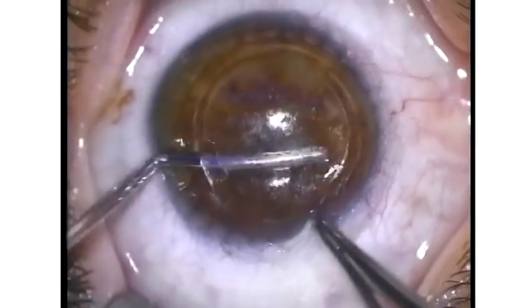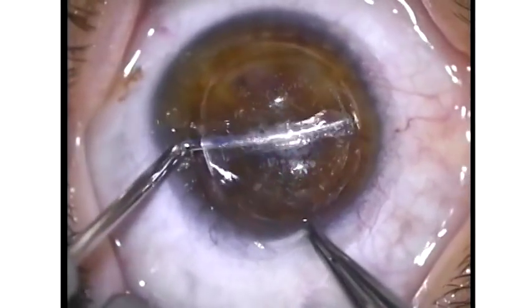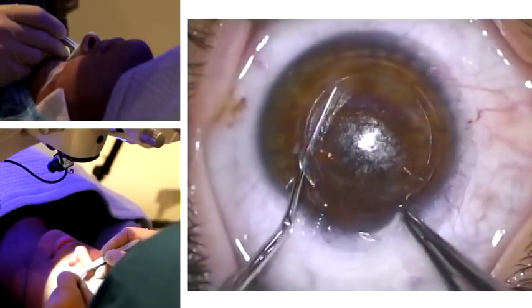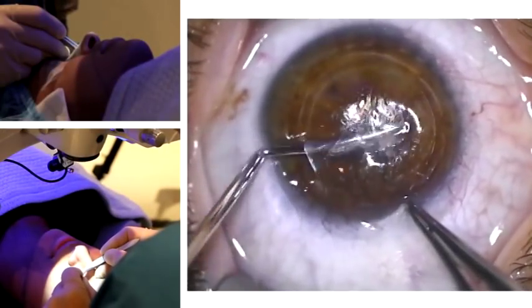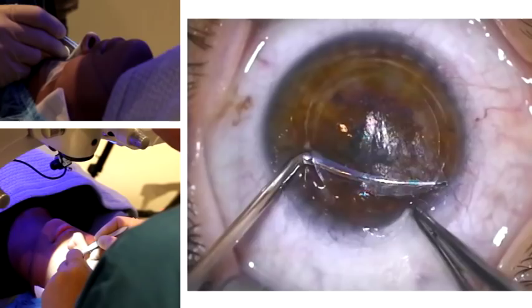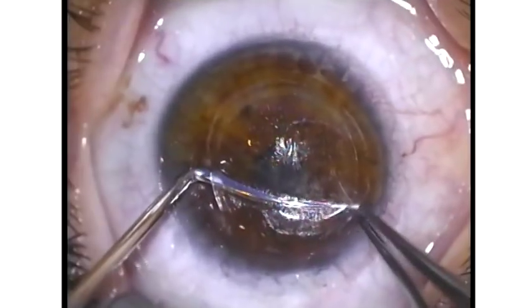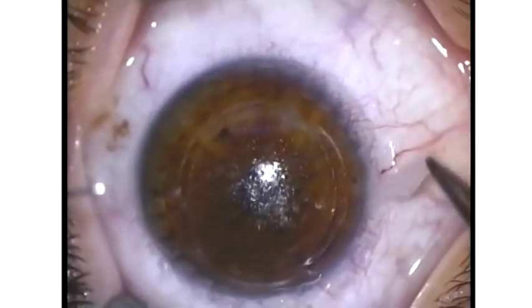The already identified lower interface is entered without difficulty and dissected in a similar fashion. Leaving a small area opposite to the incision until the end facilitates the lenticule mobilization and removal, which can also be performed using a forceps.